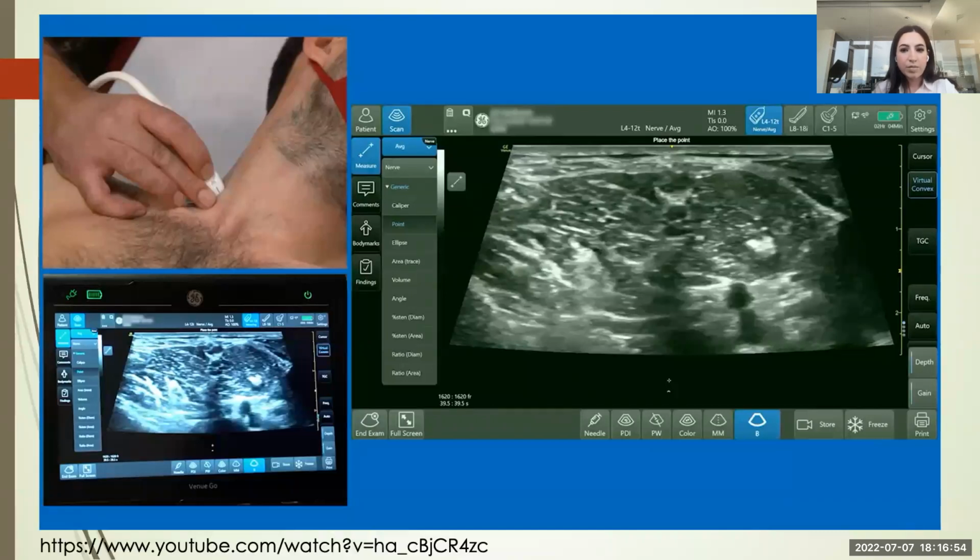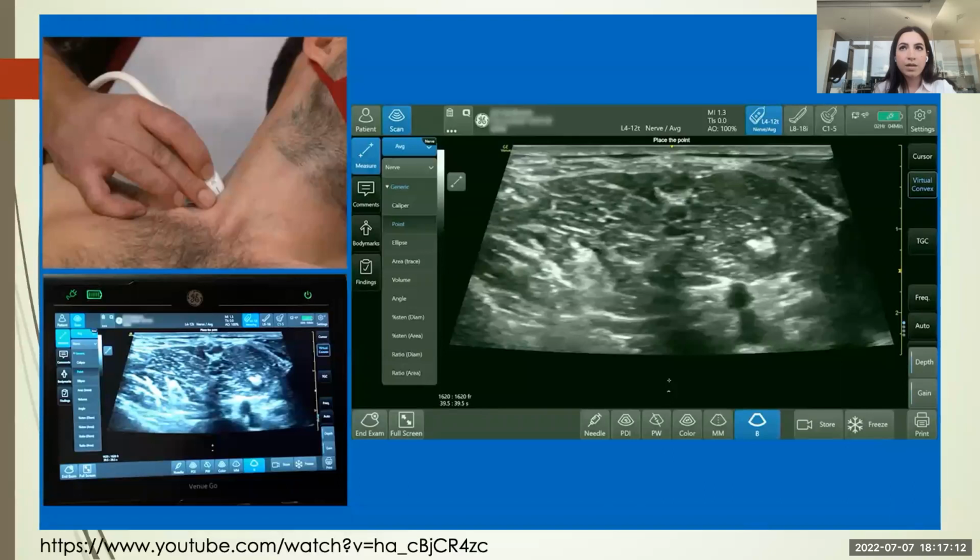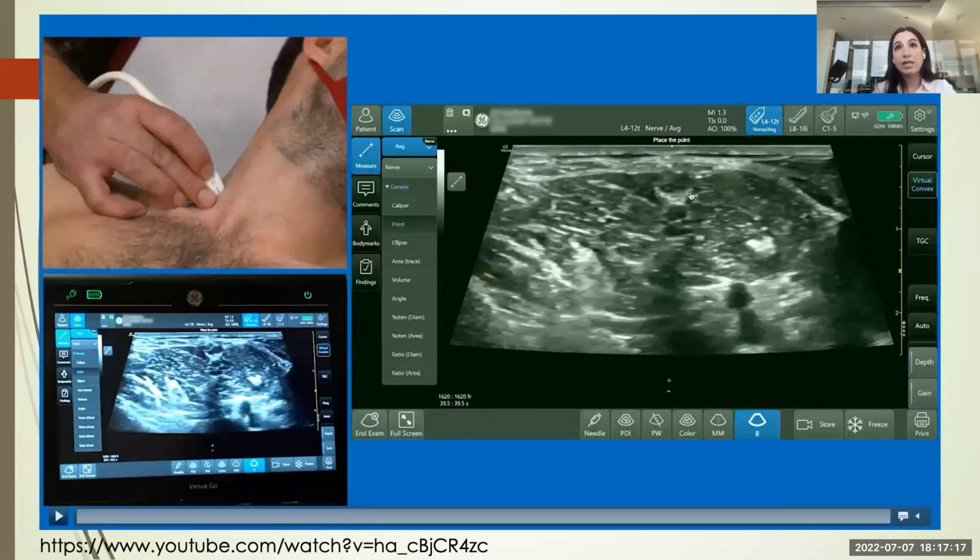I'm actually going to skip over this video for the time being, just for the sake of time, but I just quickly wanted to point out that with the interscalene block, we ideally want to deposit the local anesthetic between the C5 and C6 nerve roots, or outside of the sheath right next to it. And so in this particular image, we can probably say that that's C5, this is C6, and a more bifid appearance, and C7 further down here, but we're not entirely sure.